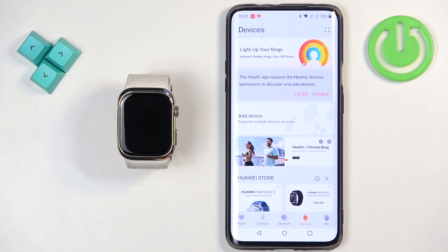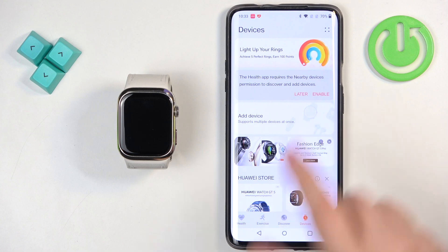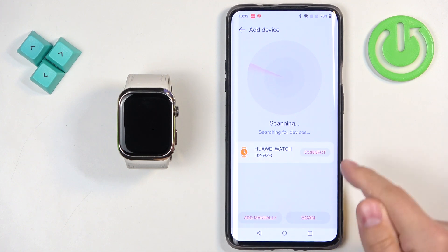Now tap on devices. Here you will see a button called add device — tap on it. Allow the required permission and it will start scanning for nearby devices. It should detect our Huawei Watch D2. Once it detects our watch, tap on connect.